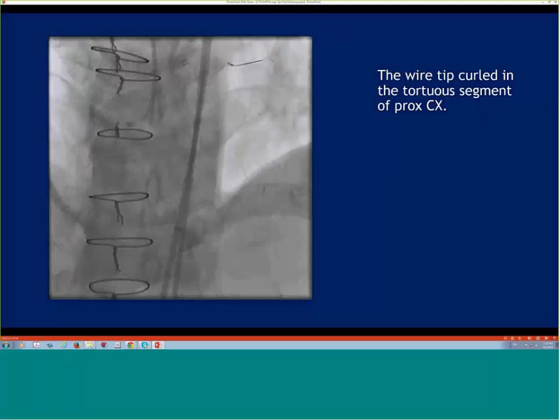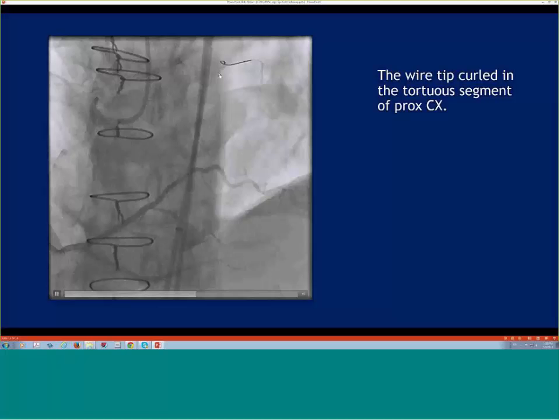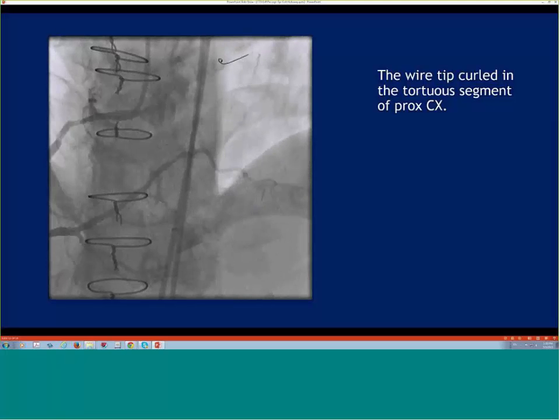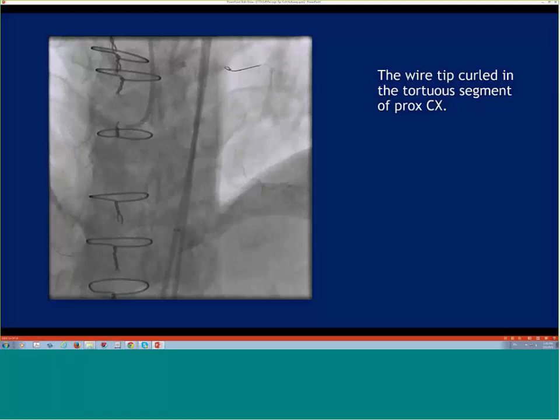Well, if I can go back one, it would be interesting to inject antegrade here and see how far you are. But one option might be to just go antegrade now. The ambiguity is kind of resolved, right? You can potentially just go antegrade and try to stick for where the wire is, just use it as a marker only.